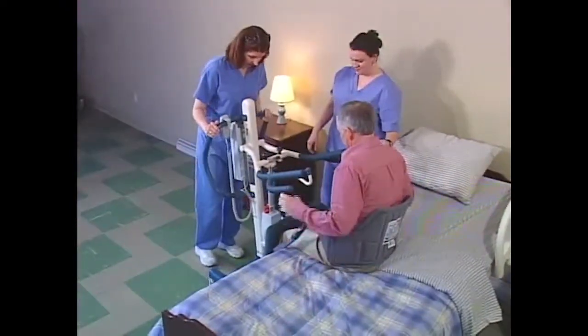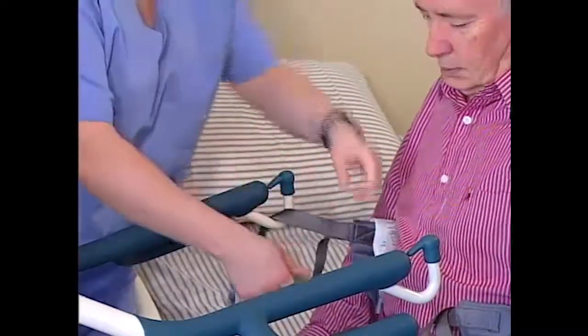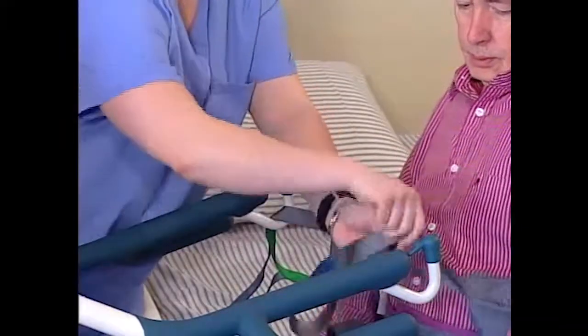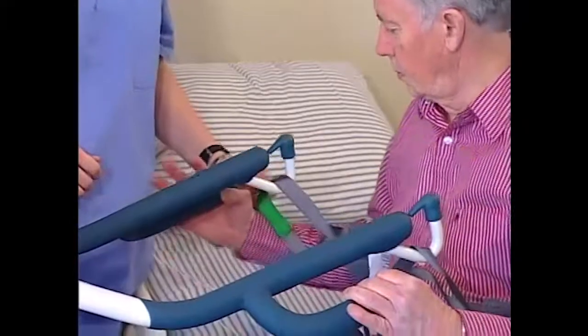Transferring a resident with a rose lift is similar. Where the procedure varies from the reliant lift is in the attachment of the straps. The arms on a rose lift have a single attachment point at the end of the lifting arm.